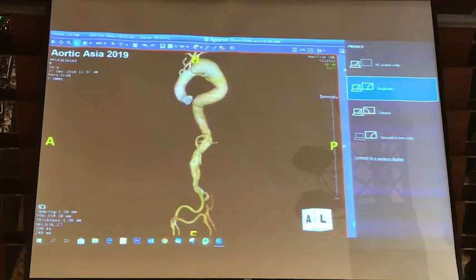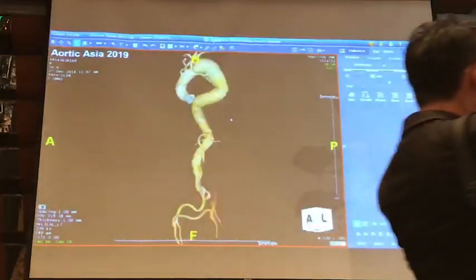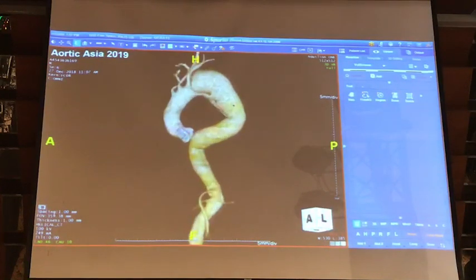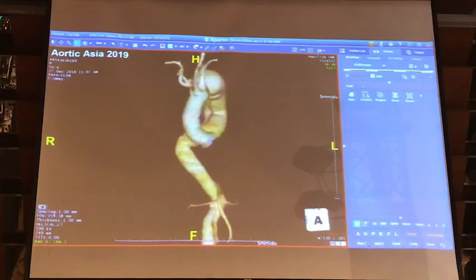Left lower limb ischemia, and that was treated by a standard femoral bypass at the time, and the rest treated conservatively. So he was managed conservatively over the past 6-7 years, with serial CT scan follow-up, and the bottom is not a problem. What you can see is that he has now developed a chronic dissection at the top. Another issue is that if you look at the back, there is an aberrant right subclavian artery, which is quite sizable, about 12 millimeters in diameter, coming from a rather narrow part of the true lumen.